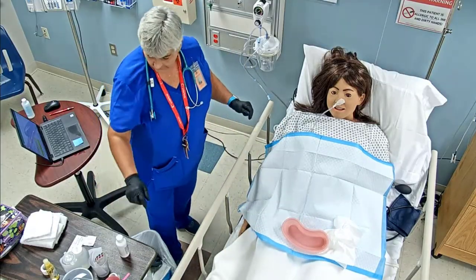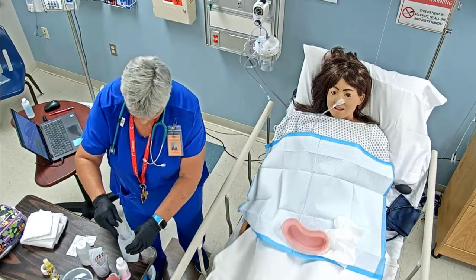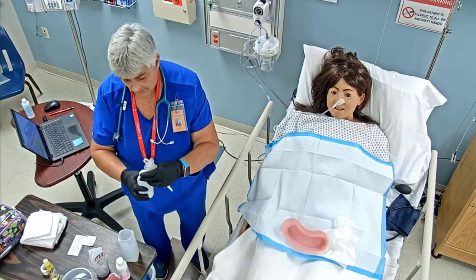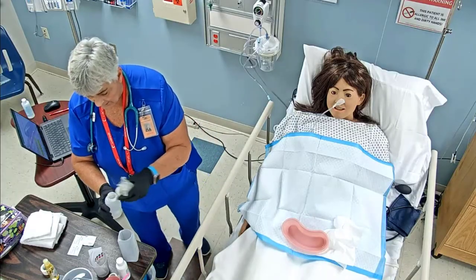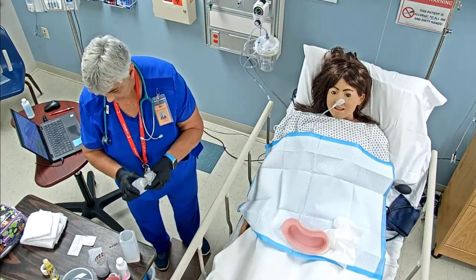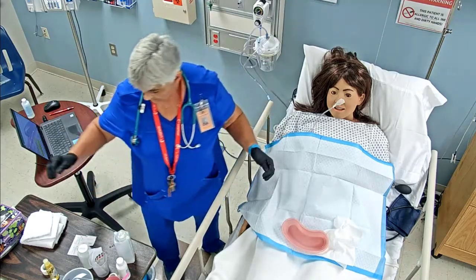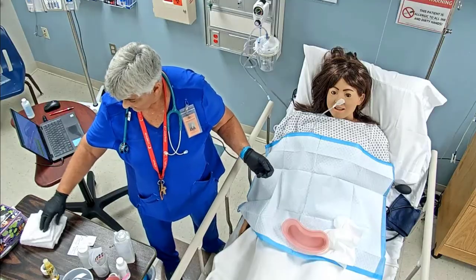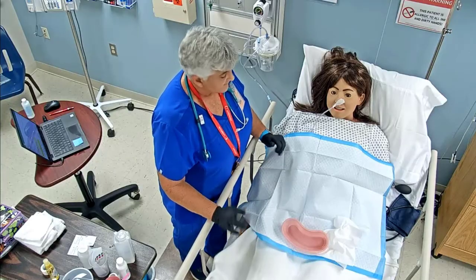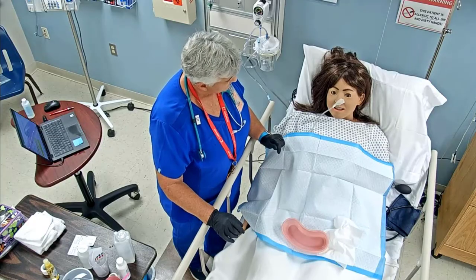I also have my solidifier. I've got my sterile water, and I'm going to go ahead and just pour some of that in there. Again, we've checked to make sure the expiration date's what we had already brought in here. I'm going to pour some in my container, because we're going to irrigate before we take that out, okay? So we've provided for privacy. Do you have any questions before we get started with this?